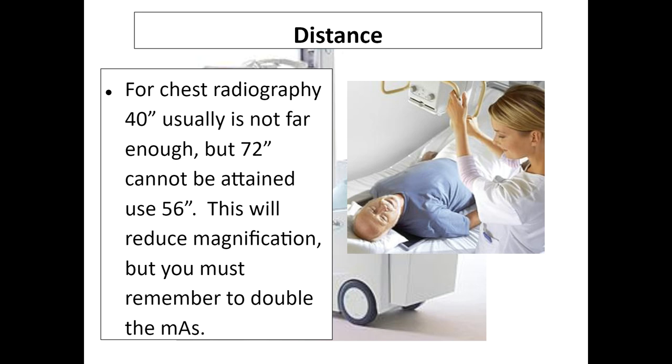If it's a stretcher, you put the stretcher down as far as it goes, and the tube up as far as it goes. Even regular beds go up and down also, but they're a little more complicated. You have to be careful because if they're hooked up to all sorts of machines and lines, you don't want to move the bed around too much and pull something out.